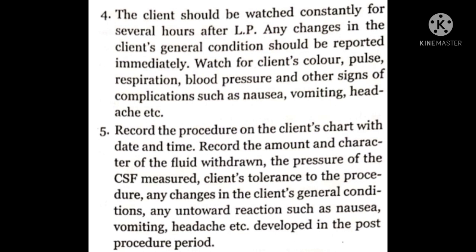5. Record the procedure on the client's chart with date and time. Record the amount and character of the fluid withdrawn, the pressure of the CSF measured, client's tolerance to the procedure, any changes in the client's general conditions, any untoward reactions such as nausea, vomiting, headache, etc. developed in the post-procedure period.